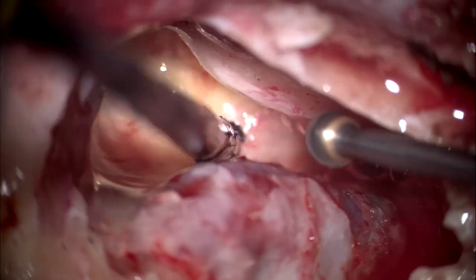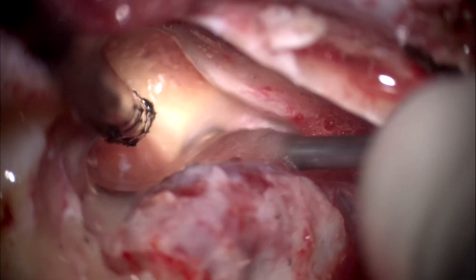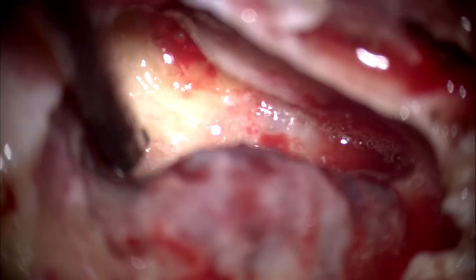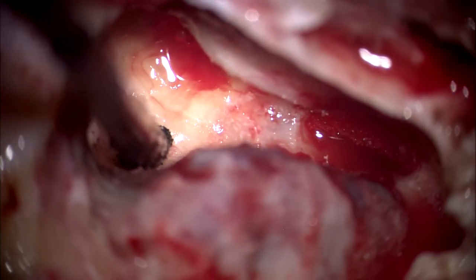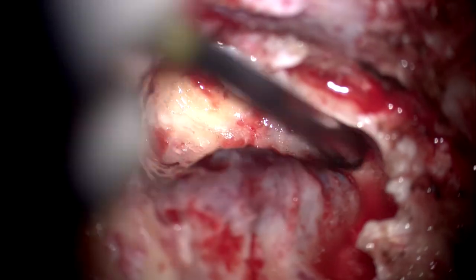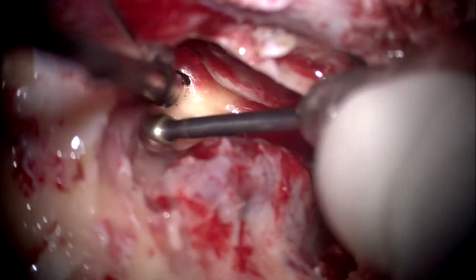Sir, I think if you can just focus a bit, please. What? Focus, okay. And I think your magnification is a bit high. If you just go one size lower in magnification. Lower? Yes, okay. That's better actually. Fine. Is the focus good now? Focus is better.